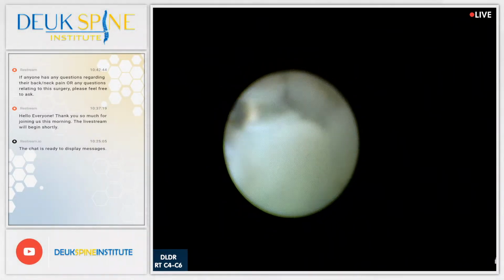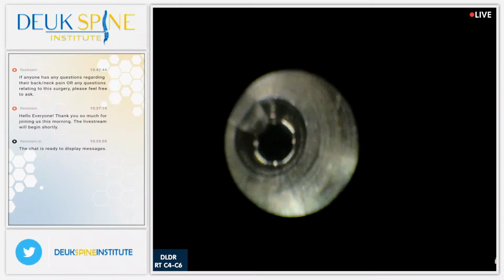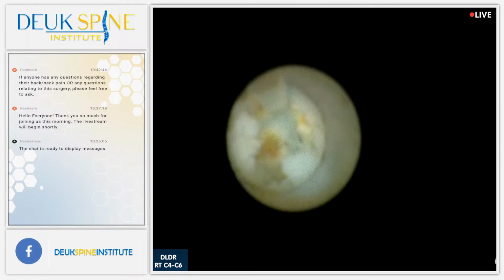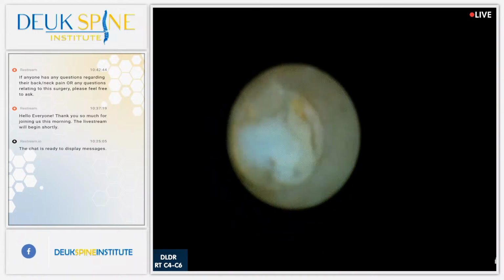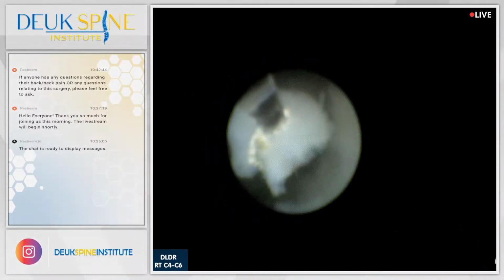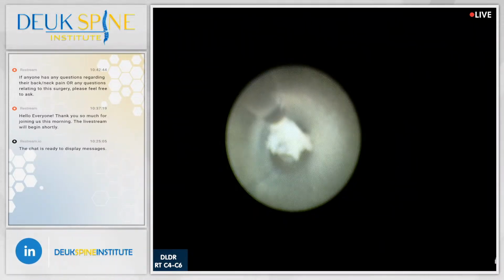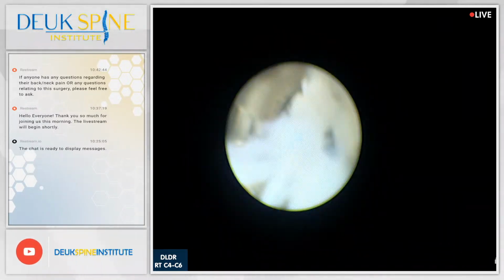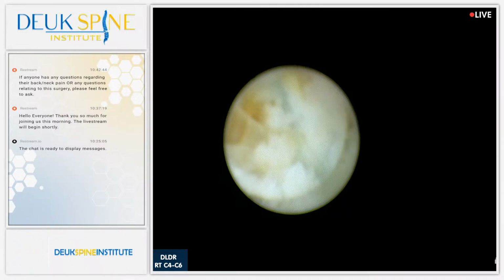This surgery you're watching has been peer-reviewed and published multiple times. There's another piece. It's a bit bright, but that's not bad. It looks like it auto adjusted the light. Is that correct? That's good. I like that. There's another piece of herniation. How many is that so far, Henry? It's like 10? I was going to say about 10 or 11. Yeah. So what I was saying earlier is that we all think disc herniation is one thing, one herniation. It's not. Turns out it's around 30 pieces on average.